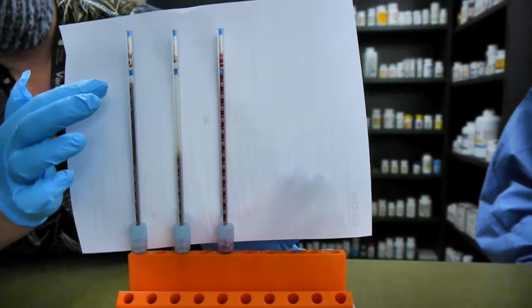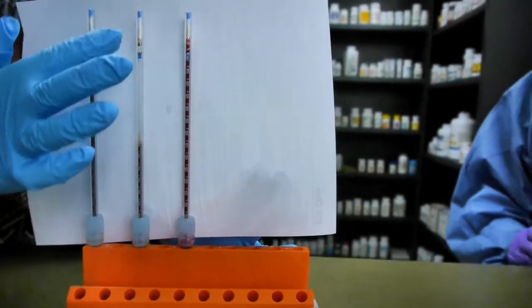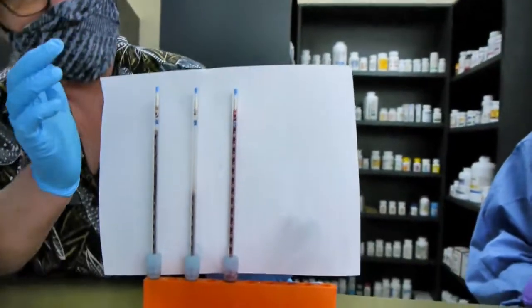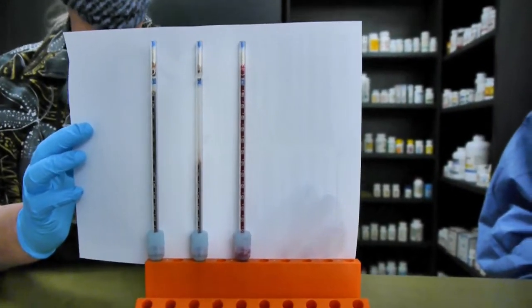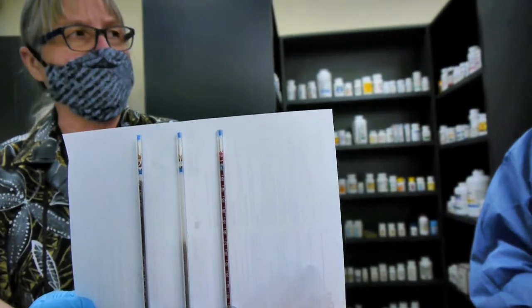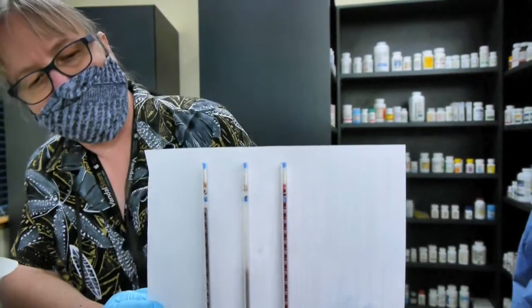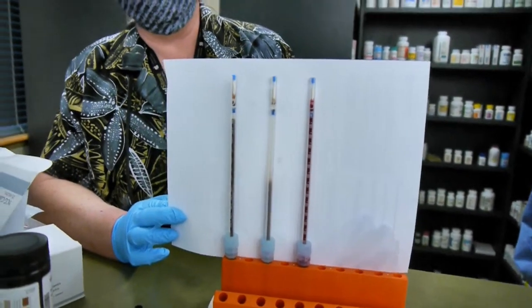Our normal control read approximately five, our abnormal control was about 68, and our patient was zero. We read and record those results. Because this is a manual method, we have to input the information into the electronic system so it can be reported. That's a simple example of how to perform a sed rate.